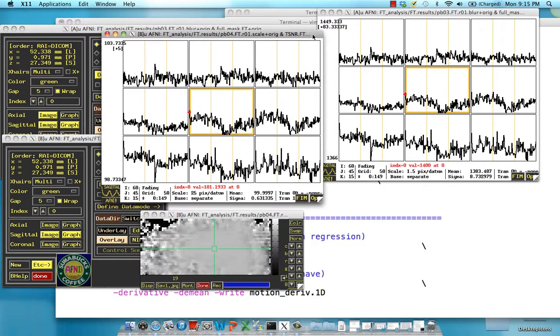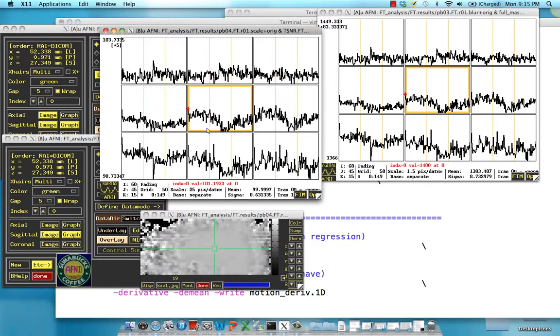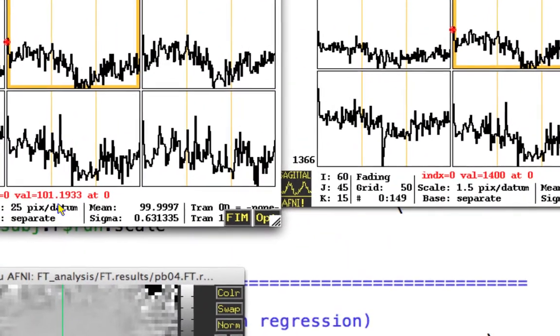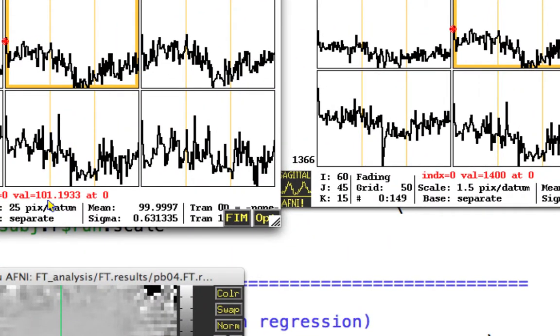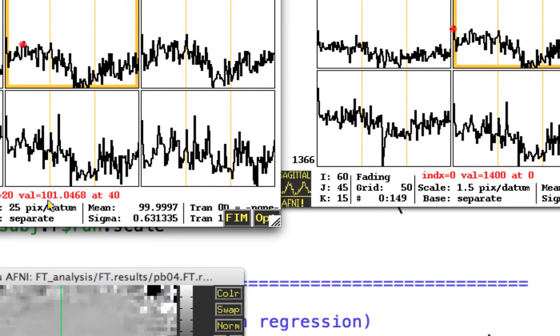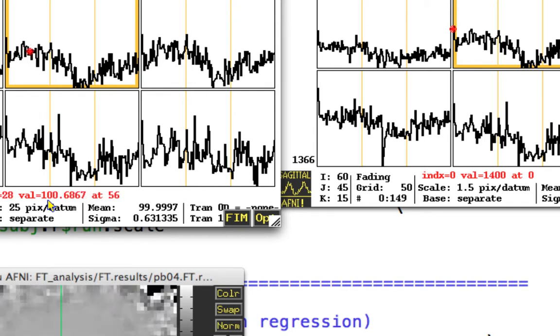Okay, so this is from the scaled data set, this is from the blurred data set. I'm going to zoom in here. Over here, you can see that the value hovers right around 100. It's because we scaled everything to 100. It goes to like 101, sometimes it goes down to 99 or so.